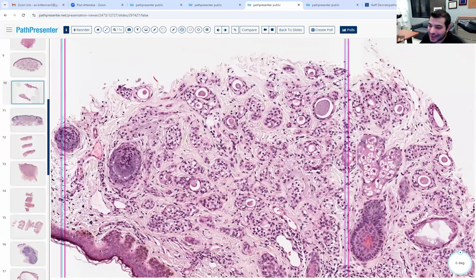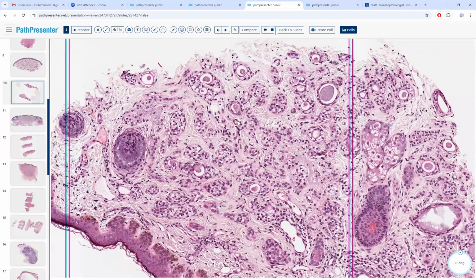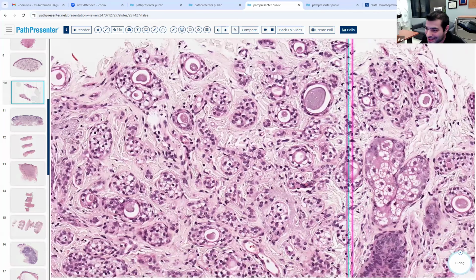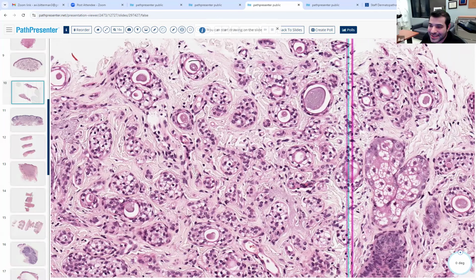So let's describe it. What do we see? You mentioned the clear cells. What structures are they making? I think they are Paisley structures. Yeah, it is like a little Paisley tie. It's just cleared out because they're clear cells. And maybe sweat in the center. Exactly. This is a little inspissated sweat over here.